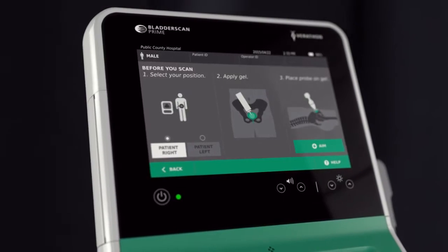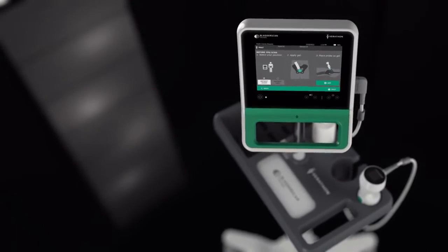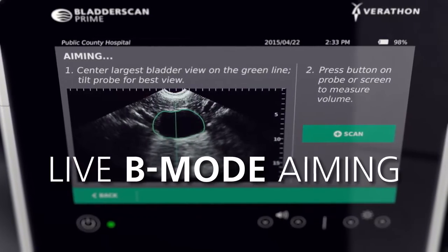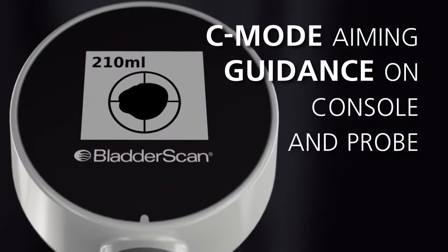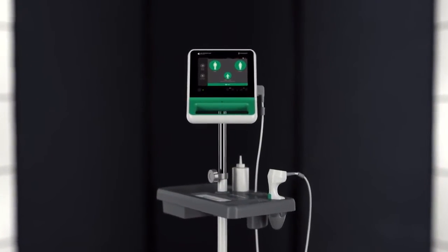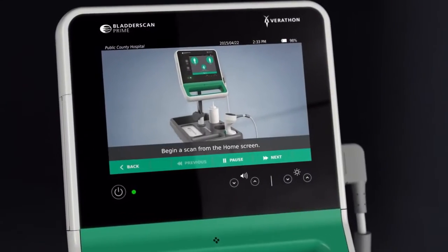Built on more than 30 years of innovation, clinical leadership, and clinical value, BladderScan Prime offers a new touchscreen console, live pre-scan imaging to reduce user error, and immediate feedback to confirm on-target scans. When it comes to clinical confidence, BladderScan Prime sets the bar higher than ever before, and it's incredibly easy to use.